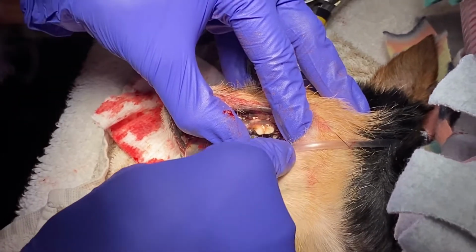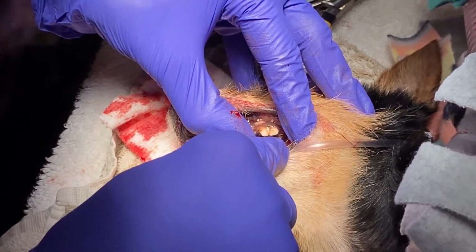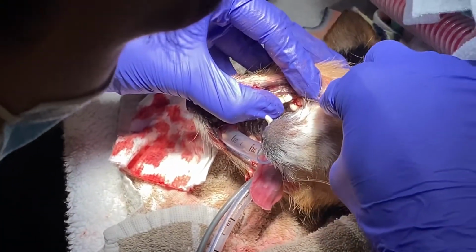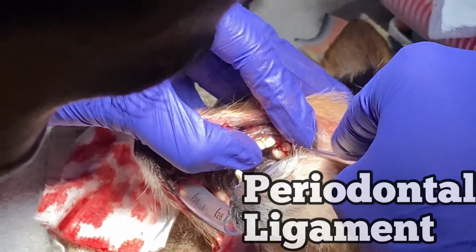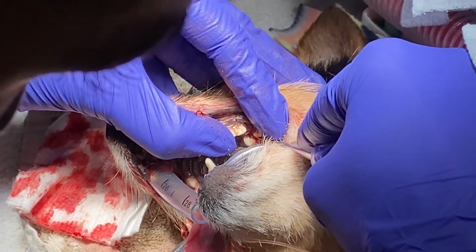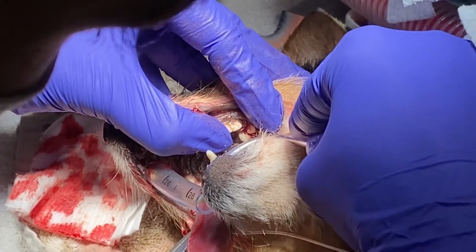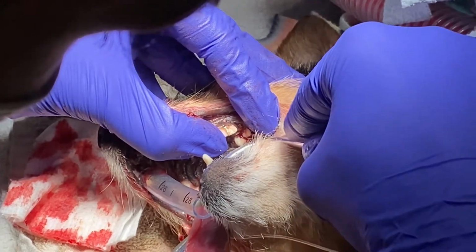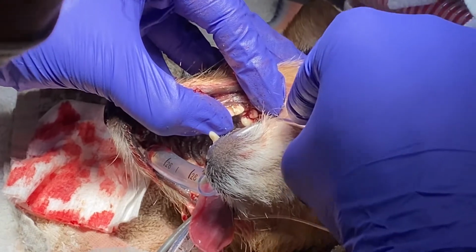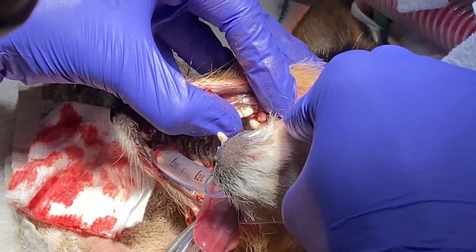So I try to go in and loosen lightly around the edge of each side of the root. Try to break down that periodontal ligament. Stretch and tear that ligament to the point where it releases the root. And my goal is not to break it, because then you have to go find that retained broken piece that you've left behind.